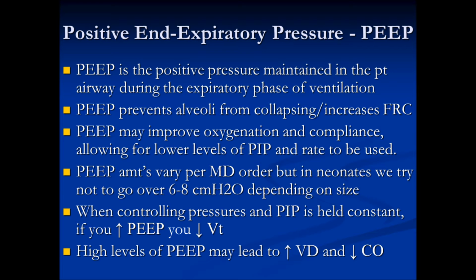It stayed in the conducting airways. And that's why when you do have high levels of PEEP, not everything that you inhale gets down to the alveoli. That is why you have increased dead space when you use high levels of PEEP. It can lead to increased dead space.